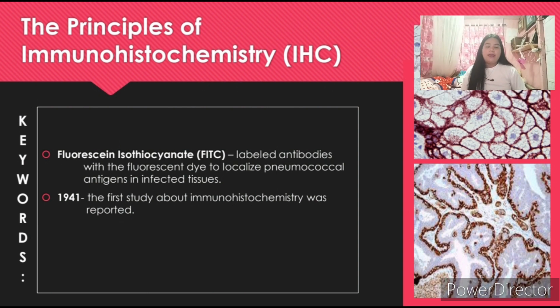Tapos, meron po tayong mga ibang mga labels. Ito ay ang radioactive elements at saka immunoreaction elements. Ito naman, mabivisualize mo sa paggamit ng autoradiography. Ang pinaka-aim naman ng IHC ay ang pag-perform ng IHC staining sa mga pasyente pero konti lang ang madadamage ng mga cell or tissue. Tapos, makikita mo na yung mga tissue typing or tissue markings, pero konti lang ang madadamage or masisira ng mga antibodies.